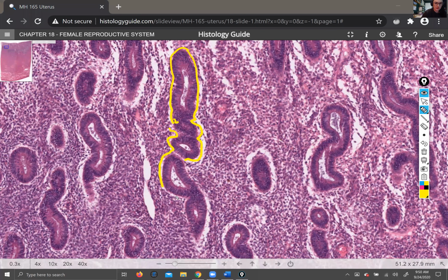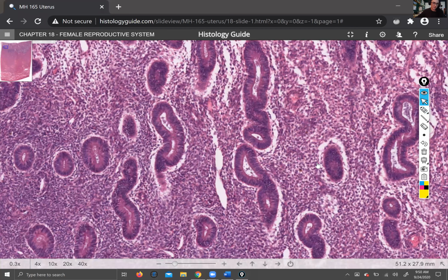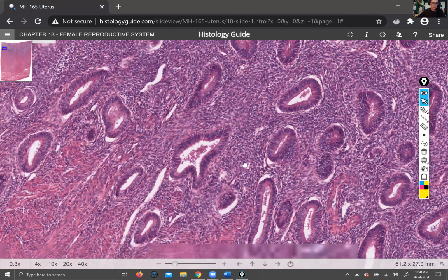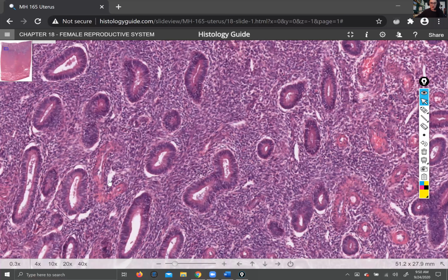And this is because during the proliferative phase, the growth of the endometrium is occurring so quickly that things get sort of scrunched, and this includes the endometrial glands and also the arteries. So I'm going to navigate back to that spiral artery so you can see an example of that. I believe it was over here and down. Where were you? There it is.